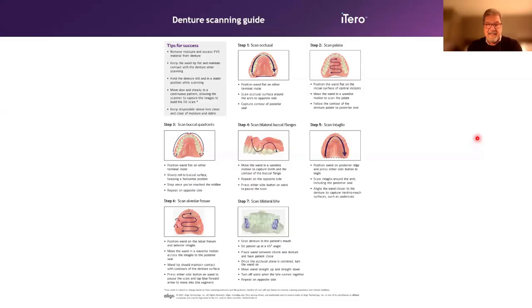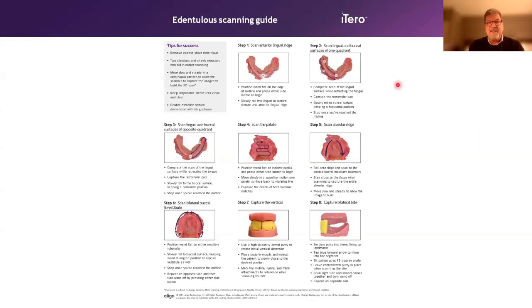This is from iTero, and this is on their website, and it's a scanning guide for brand new dentures and existing dentures. And I'll show you with a brand new denture here. What are they doing here? They're using the exact same strategy as Dr. LaRusso did on these types of scans. So if you go to their website, they have this PDF also. You can go and investigate it. But I just like to talk about this a little bit.